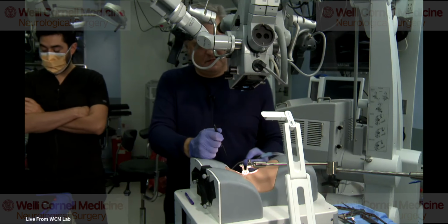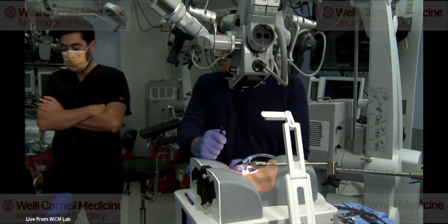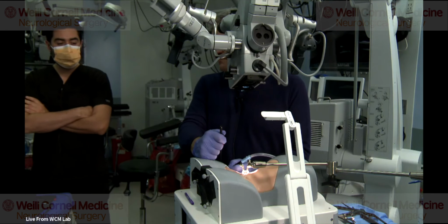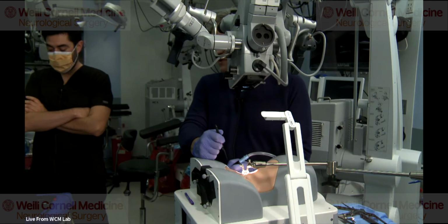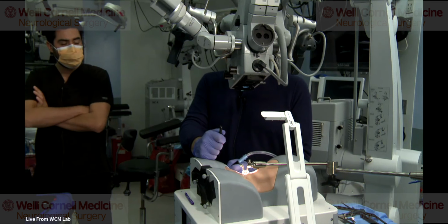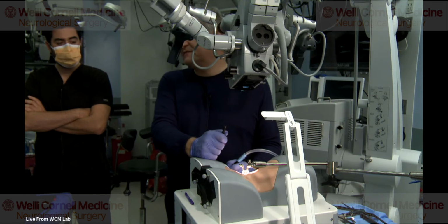Another question is, what is the risk of C5 palsy doing this procedure? It's extremely unlikely. For this type of case, I don't know if I've seen that.